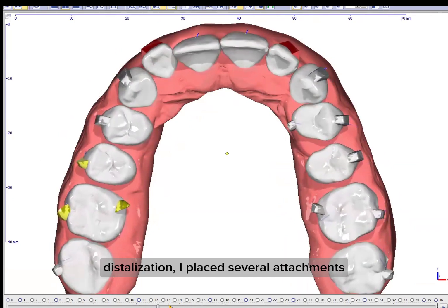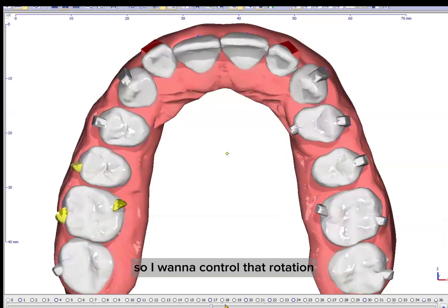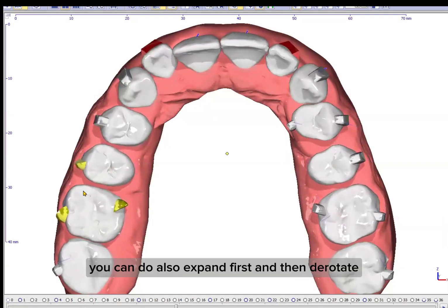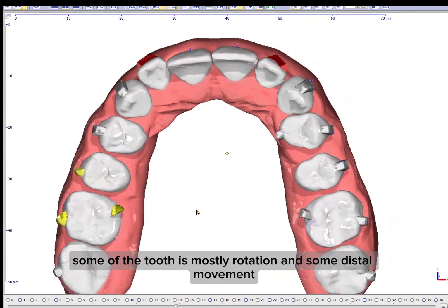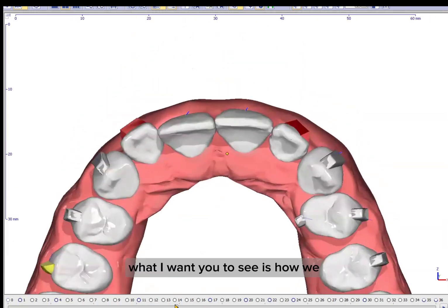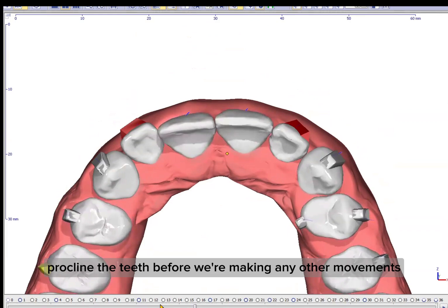I placed several attachments, even lingual ones, because we had a lot of rotation, so I want to control that rotation very well. You can also expand first and then de-rotate, but I don't have much expansion in some of the teeth — it's mostly rotation and some distal movement. But what I want you to see is how we procline the teeth before making any other movements.